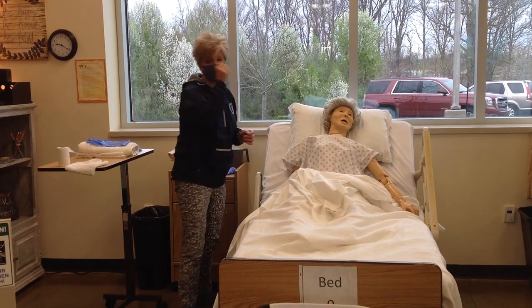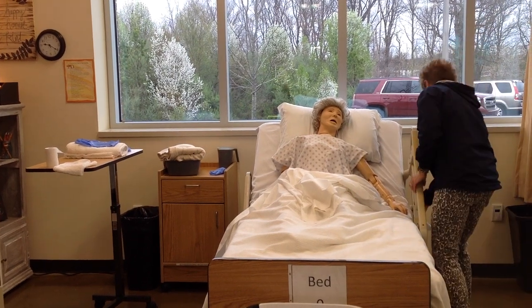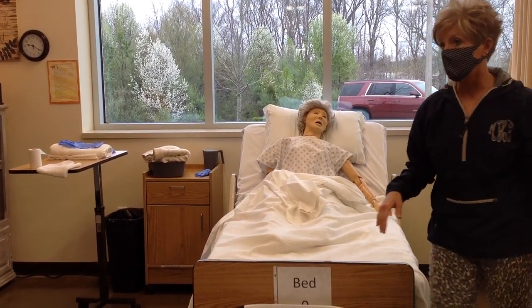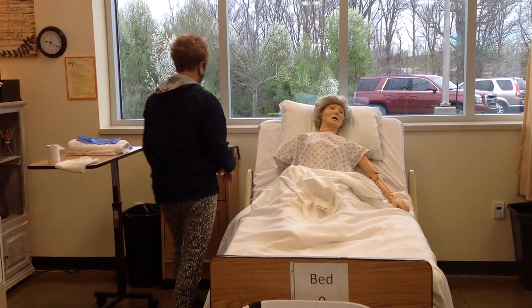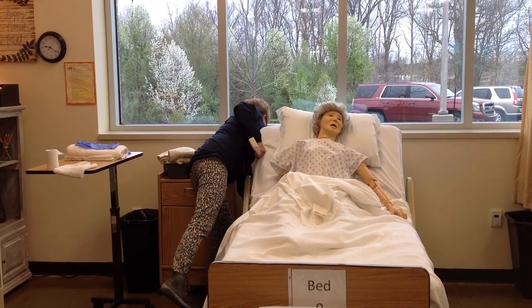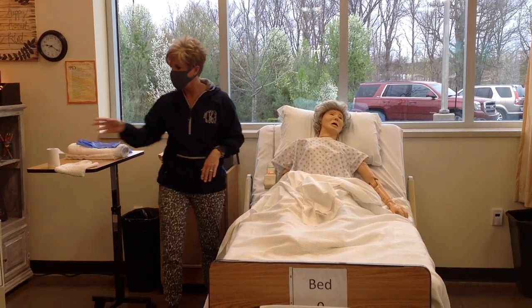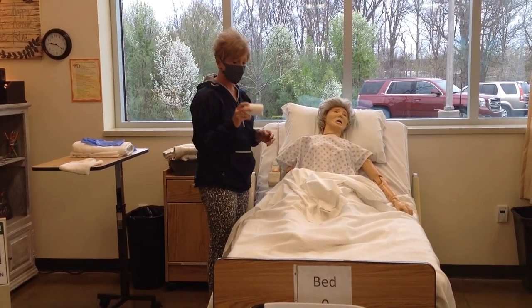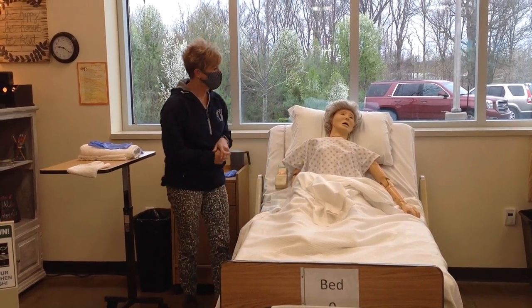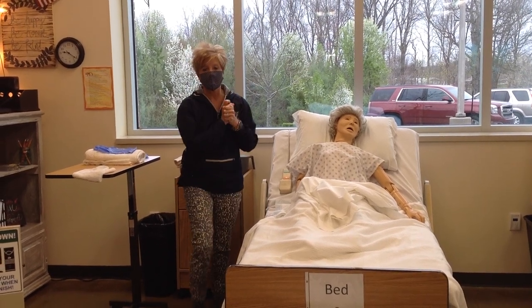Since we're leaving the room to allow them privacy, we have to make sure the bed rails are down, the bed is in the lowest position, and they have their call light. Here's the call light. We're going to give them toilet tissue in case they can wipe themselves. Just call me when you're done and I'll come back in and help you. I'm going to wash my hands and leave the room.